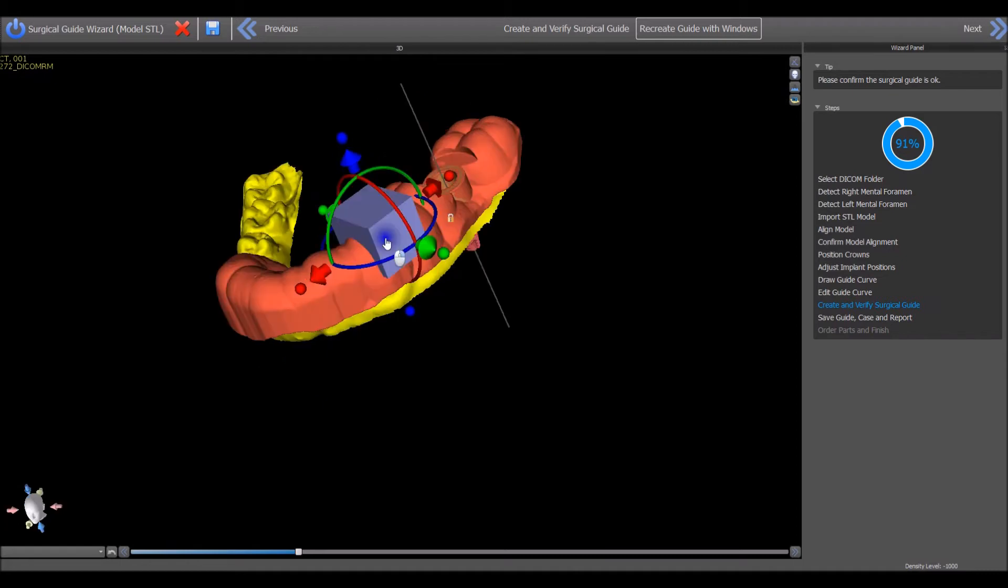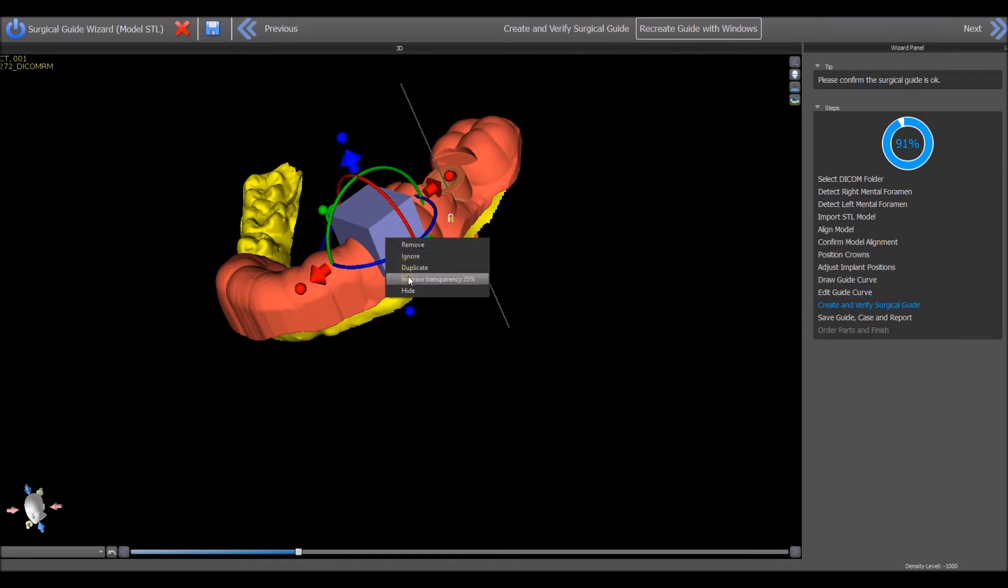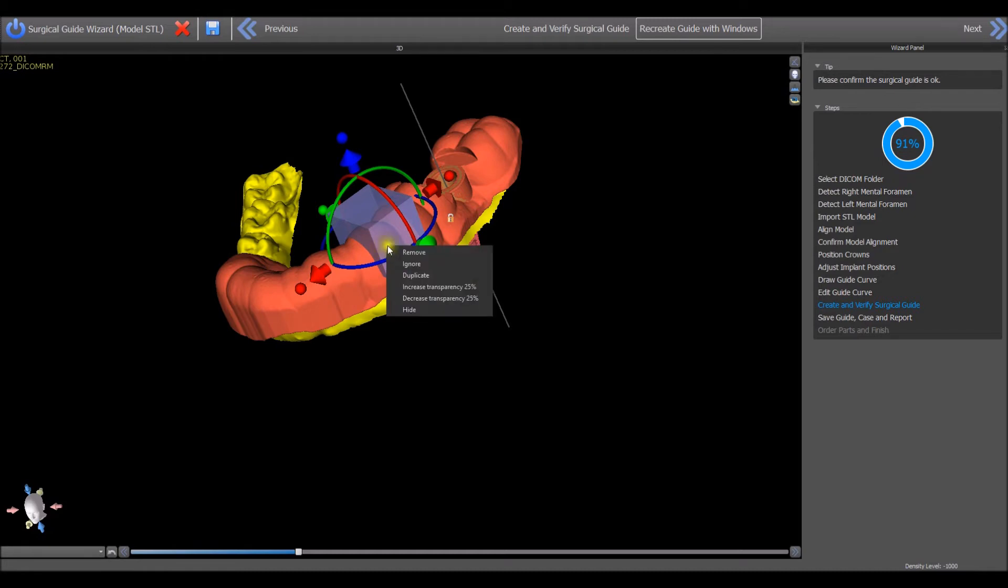For better visualization you can right click on the block and choose increase transparency. Right clicking again on the rectangle will allow you to choose to once again increase transparency or to decrease transparency.